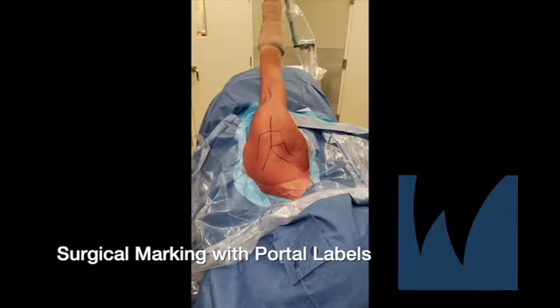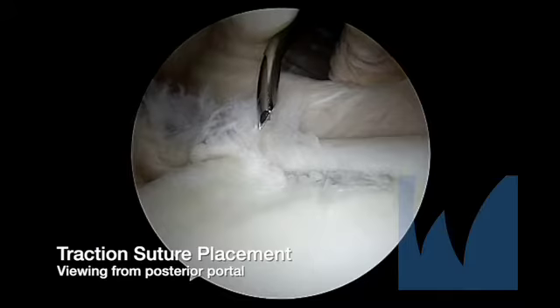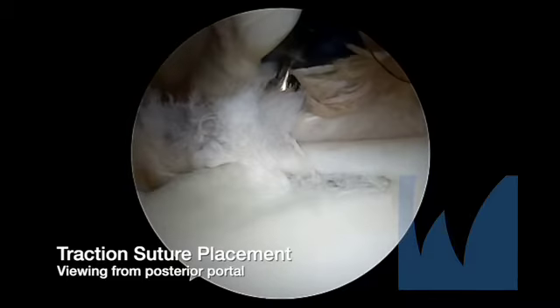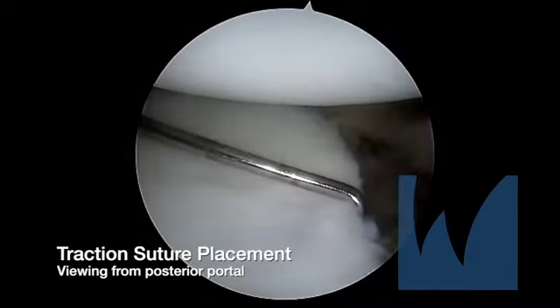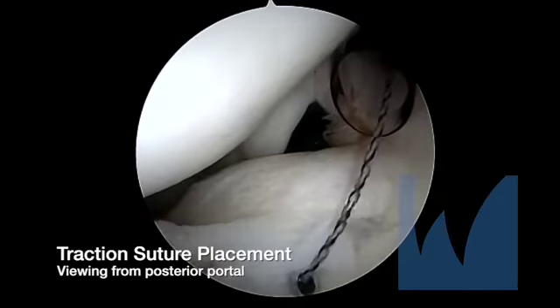A standard posterior portal is used to place an anterior superior and anterior inferior portal using an outside-in approach. A traction suture is placed at 3 o'clock in the anterior labrum and secured with a racking hitch knot. The suture will be used for control and manipulation of the labrum later in the procedure.